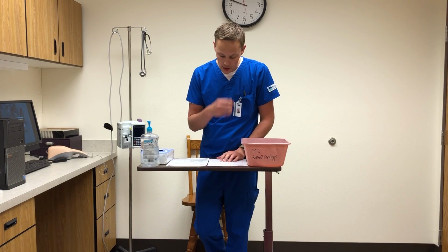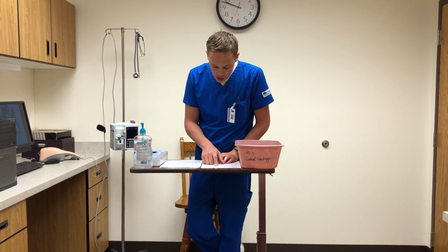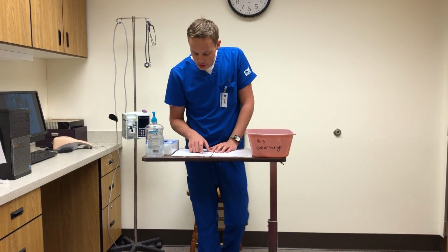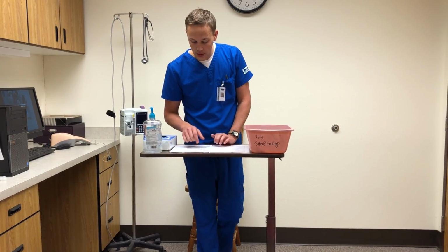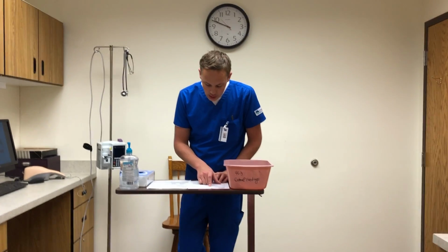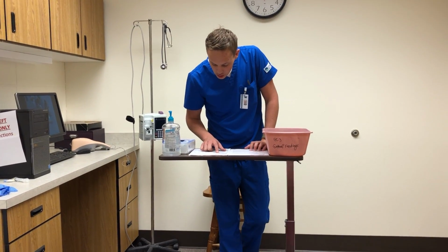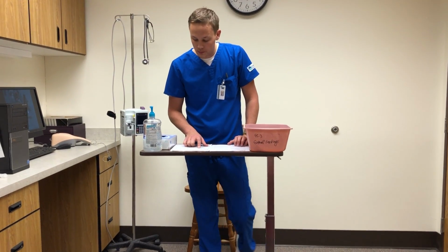And the first medication on the provider order is a NPH insulin U100. And it's an order for 15 units subcutaneously daily with supper, and that's what's on my MAR as well. Demo dose NPH insulin U100, 15 units subcutaneous daily with supper. So I know that that's correct. My next one is a regular insulin U100 for 10 units subcutaneously BID, and here on the MAR, regular insulin U100, 10 units sub-Q, BID.